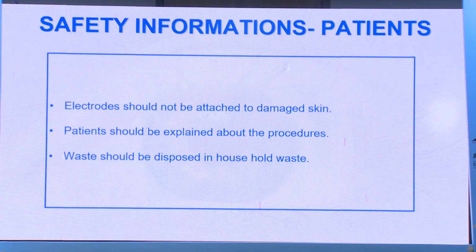For the patients, electrodes should never be used on damaged skin. The patient should be thoroughly explained the procedure, and all doubts have to be cleared, and the waste should be disposed of in the household waste.